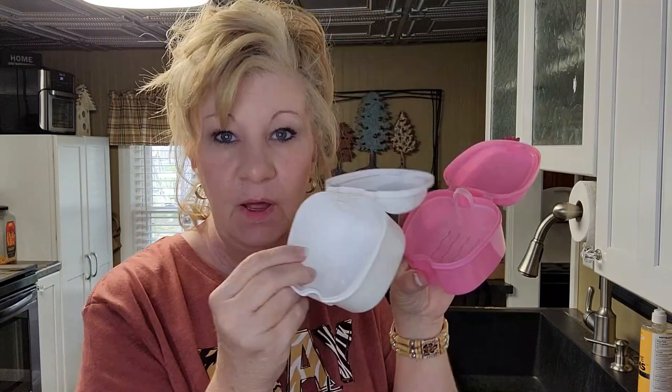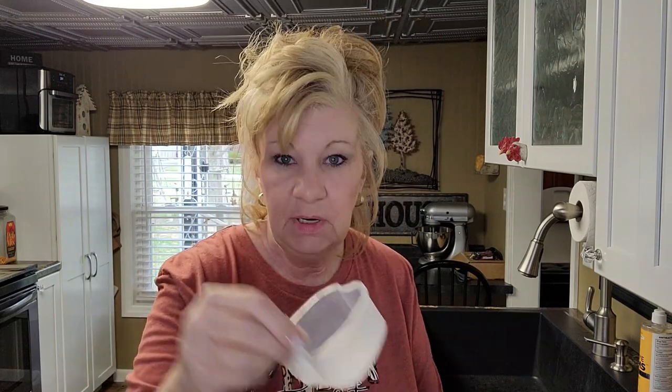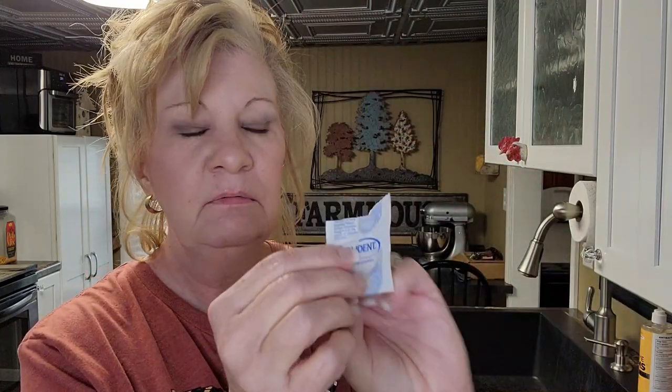It just all of a sudden hit me one day — I need stuff. You need one of these. I actually have two of these because I run one through my dishwasher every once in a while. Inside there's a tray that fits in here and your teeth go inside, along with these tablets — it comes in a strip that you can rip off.